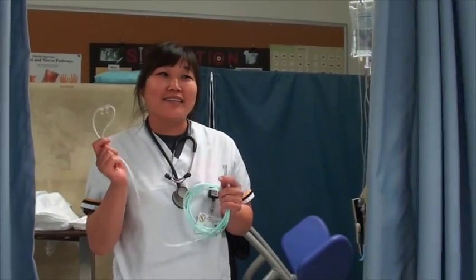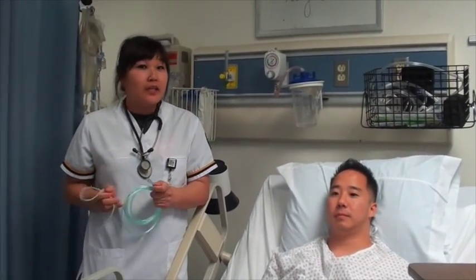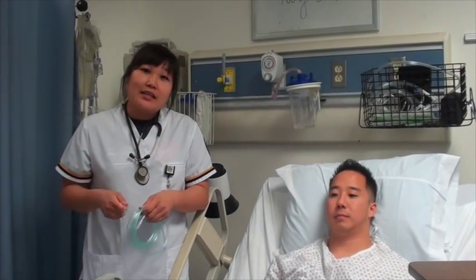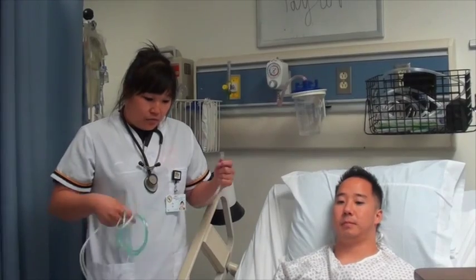Hi Josh, I am option number 1, the nasal cannula. The nasal cannula is one of the most frequently used devices, and the great thing about it is it allows a lot of freedoms that a lot of the other oxygen devices do not give, such as being able to eat or talk while the device is on.